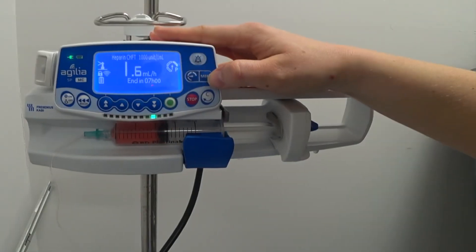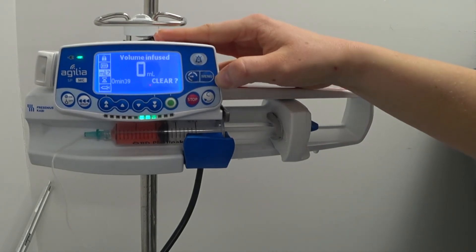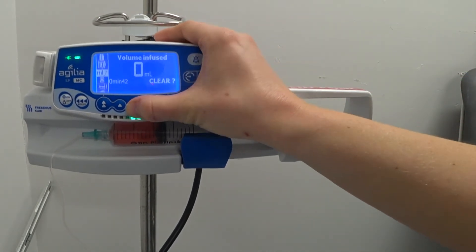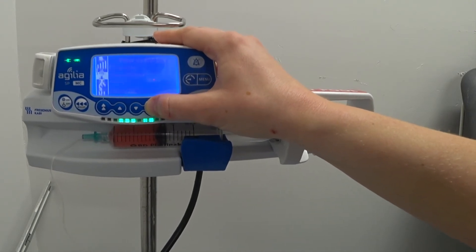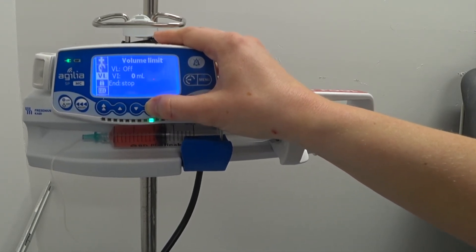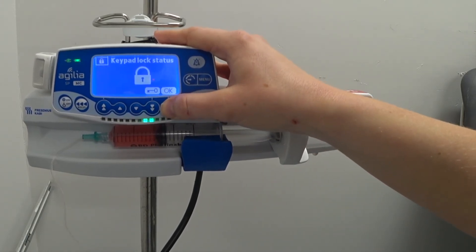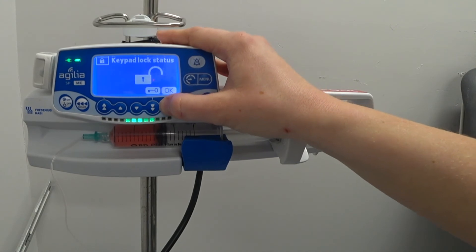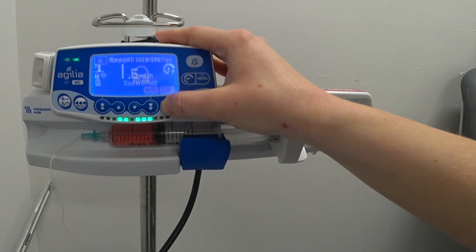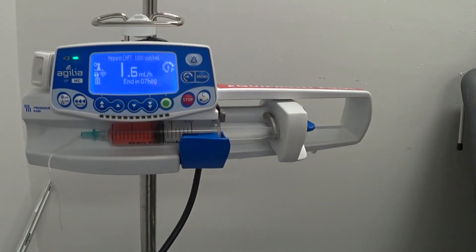To lock and unlock the machine, we press the menu, go down to the padlock, press enter and you can lock and unlock from here. Once you've unlocked or locked, you can press OK and it will go back to the main screen.